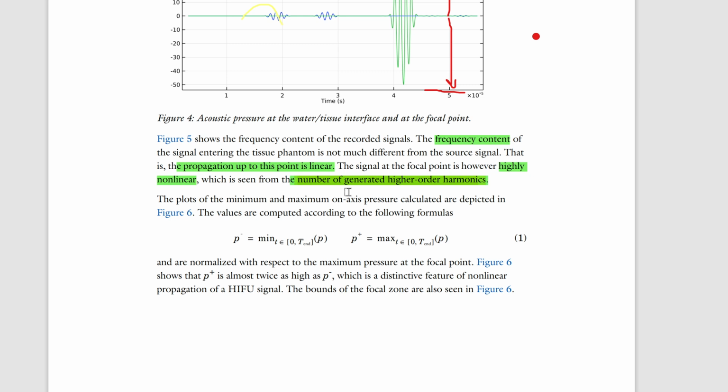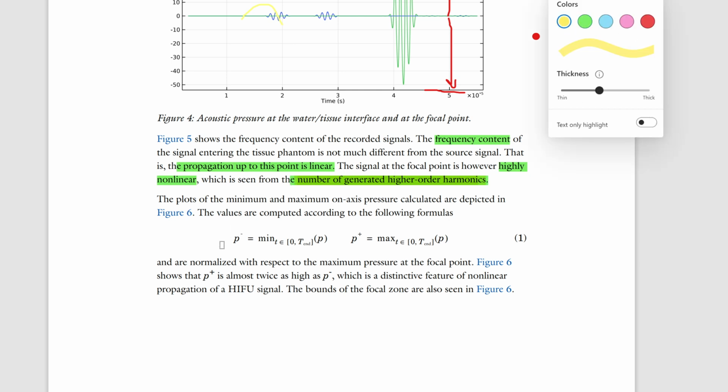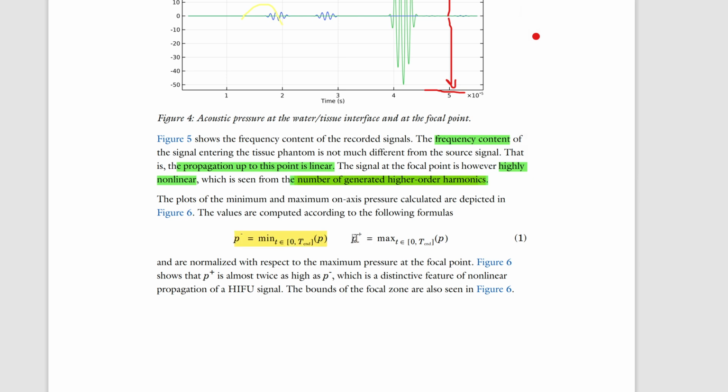The plot of the minimum and maximum on-axis pressure calculated are depicted in Figure 6. The values are computed according to these formulas. Okay, let's look at the formulas. And I'm going to go straight to what the units are. And are normalized with respect to the maximum pressure at the focal points. So minimum and maximum on-axis pressures. Well, let's change this to pink. Pink here. Minimum on-axis pressure equal to the minimum this. Maximum, okay, we've got this.